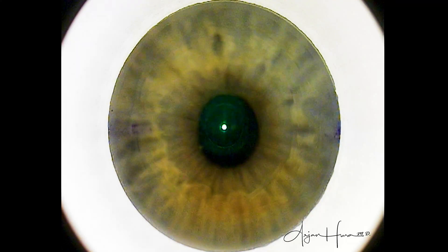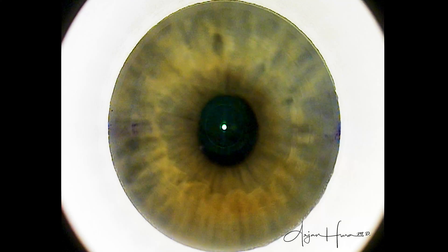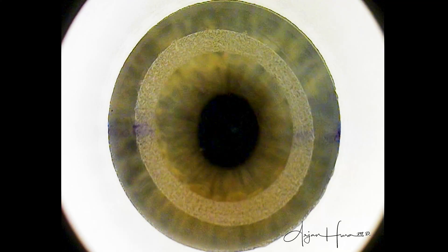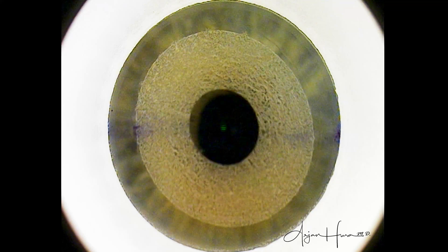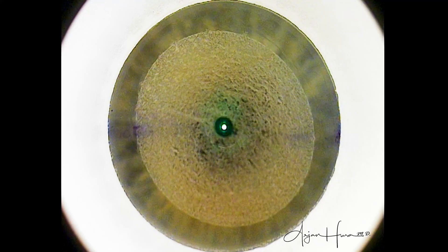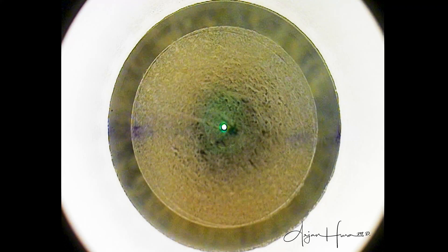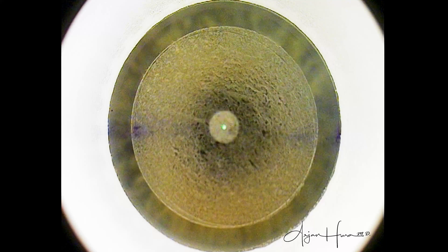We have just established suction and we're about to start the SMILE surgery. This first outside-in cut is the refractive cut, or lenticule cut, and this is what is actually treating the patient's refractive error. Next, if you look at the periphery, the side cut, or the edges of the lenticule, are established.